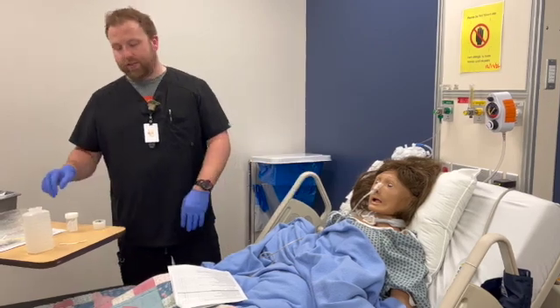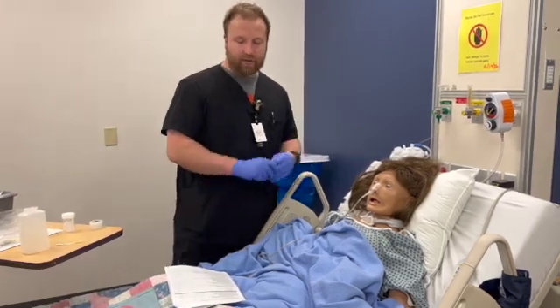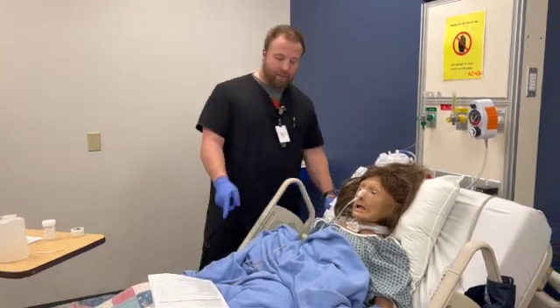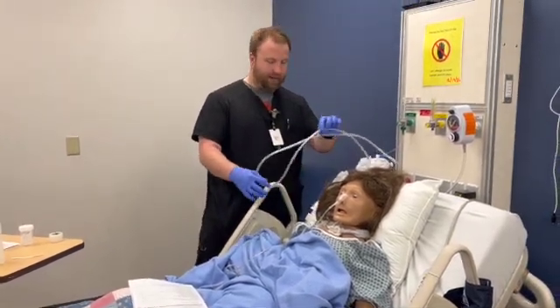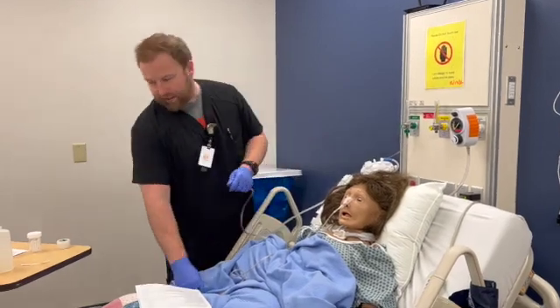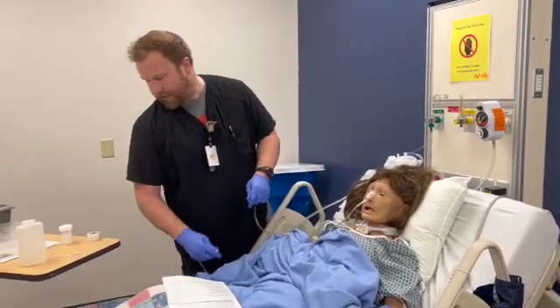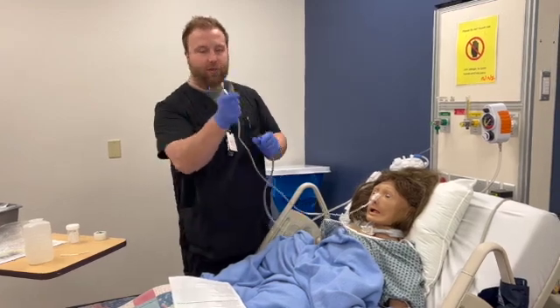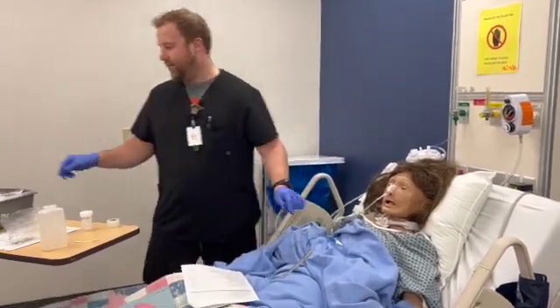We're going to discard our supplies appropriately, remove our gloves, wash our hands, and assist the patient back to a comfortable position. After we get back from x-ray, we can connect our suctioning. You'll have a little connection piece there. Your suctioning connects to this tubing. It does not connect to this.